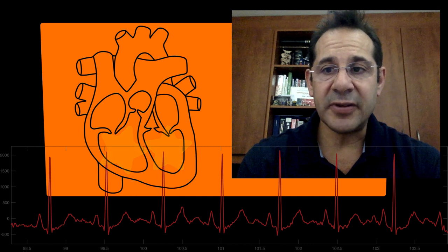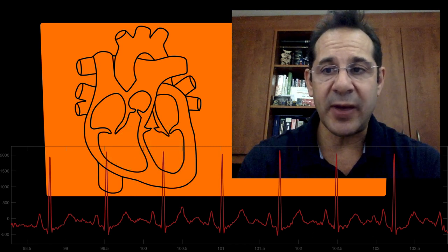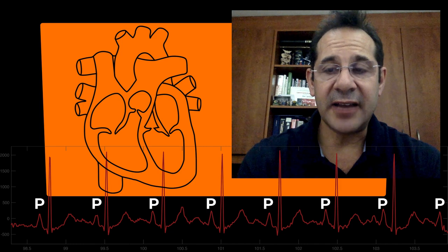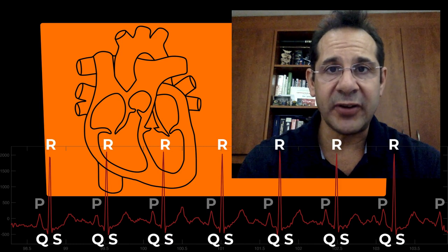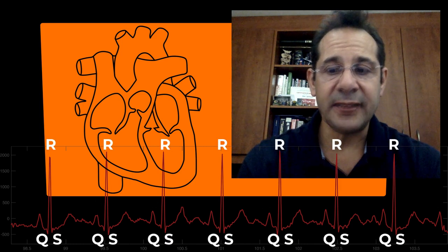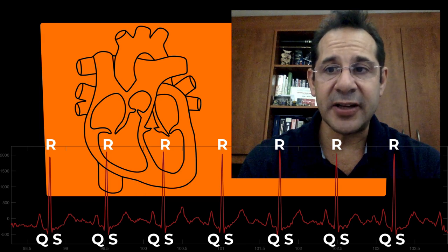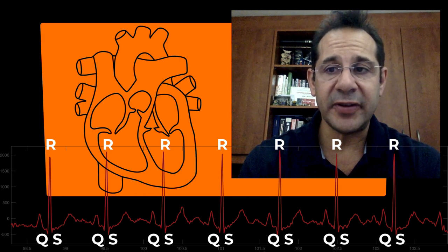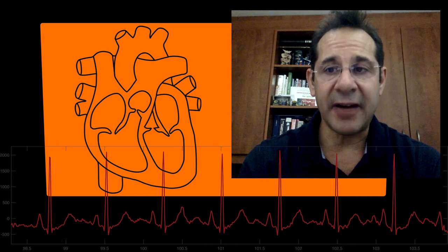The atrium creates an electrical wave on the ECG called the P wave, illustrated here, and this is then followed by a narrow, tall beat called the QRS complex. The QRS complexes in a normal individual, or with a normal heartbeat, are narrow.